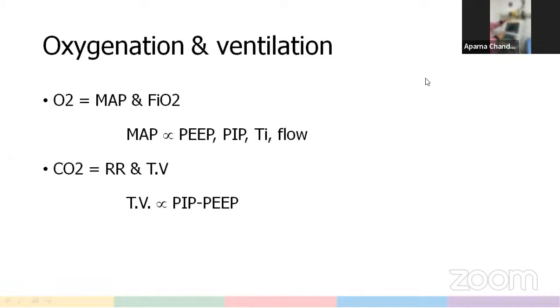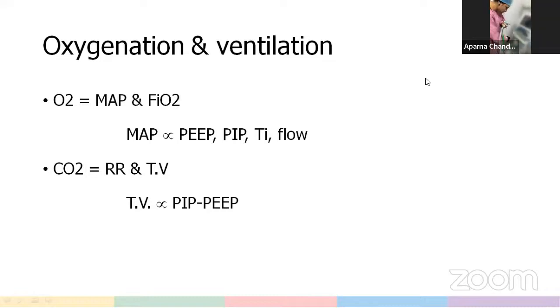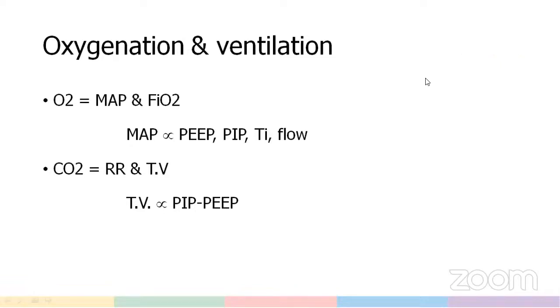Then we have the ventilator interface. We have the patient outlet or inspiratory circuit, which goes to the heated humidifier and then comes out through this green tubing into the patient interface. This is the expiratory tube here that goes through the water trap and back to the machine. So there is a continuous flow through the ventilator, which is called bias flow or base flow, which for instance is fixed at a flow of around 10 liters per minute.